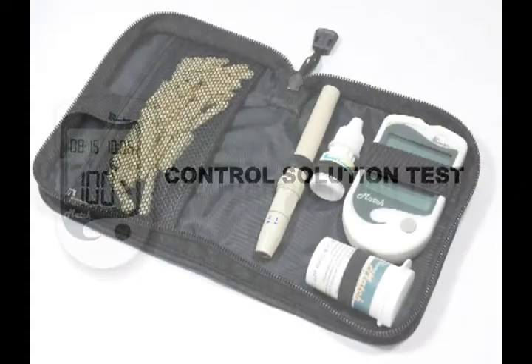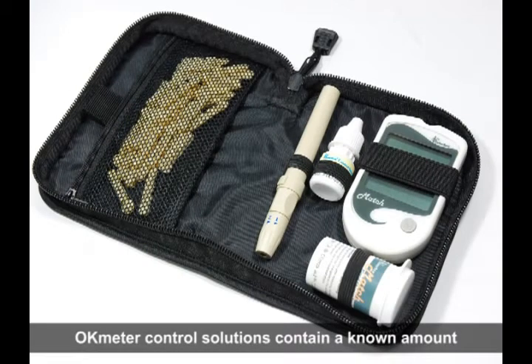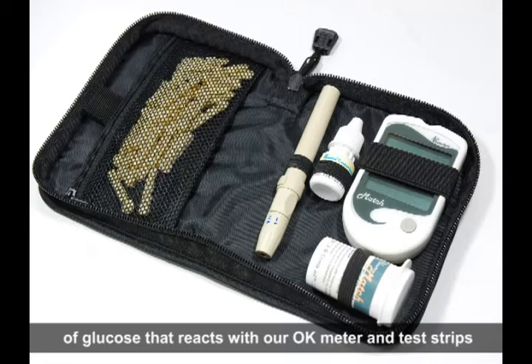Control Solution Test. The OK Meter Control Solution contains a known amount of glucose that reacts with the OK Meter and test strips.